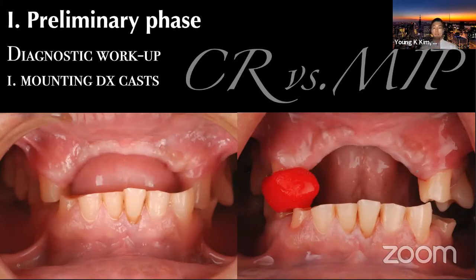You can use a leaf gauge if you have it in the practice. I use a leaf gauge for all of my occlusal guard cases because it's easy to use. But for this case, we can't really use it because the patient's missing the anterior incisors. So we couldn't really use it anyway.